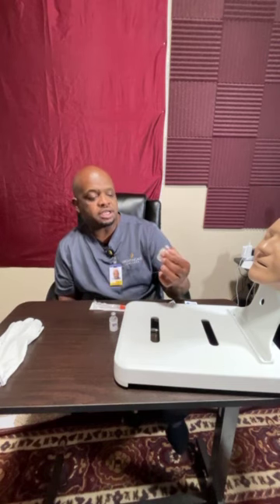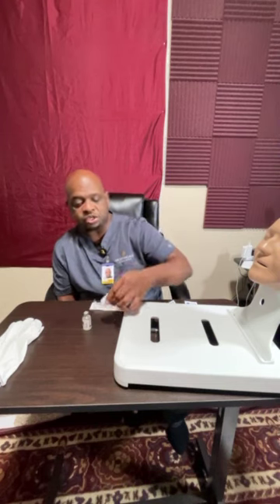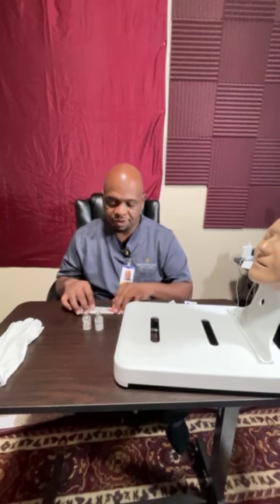As I said, we're going to be drawing up insulin. It's going to be two different types of insulin. The first one is going to be 4 units of the regular insulin. This is the fast acting. The second one is going to be 8 units of the NPH, making it a total of 12 units in one syringe, so that the patient would only receive one injection for comfort.